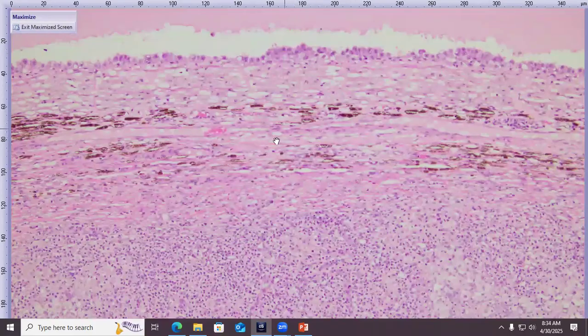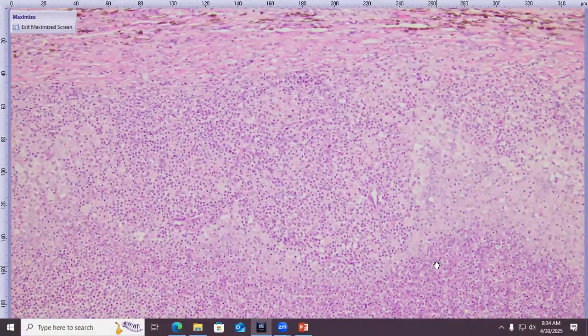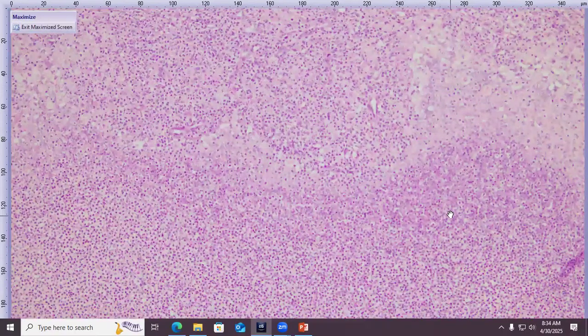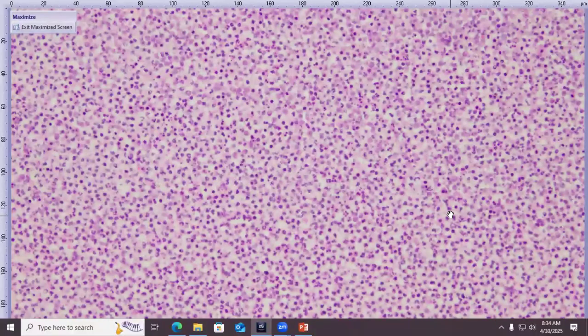We have our choroidal stroma here, and then just melting into this area that is very much affected by a certain process. So roughly from here to here, we basically just have this thick fibrovascular lining, which is infiltrated by large numbers of neutrophils. And then there's neutrophils and macrophages kind of clustered along the inside of that. And then this just gives way to this giant cavitated space, which is filled with variably degenerate neutrophils. And we'll confirm that on closer look.